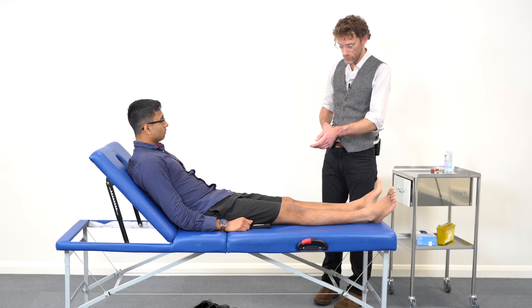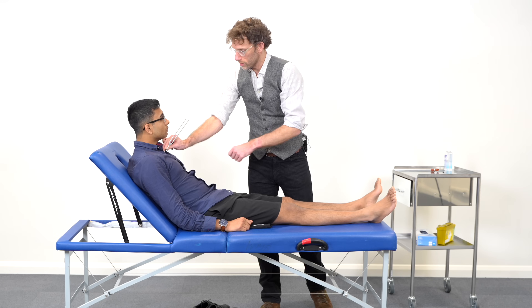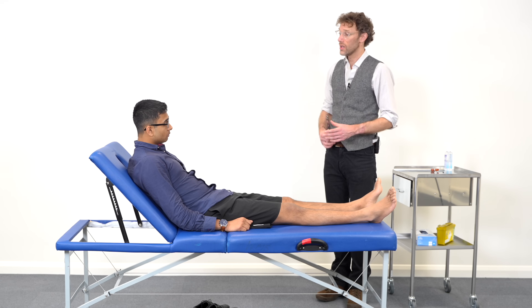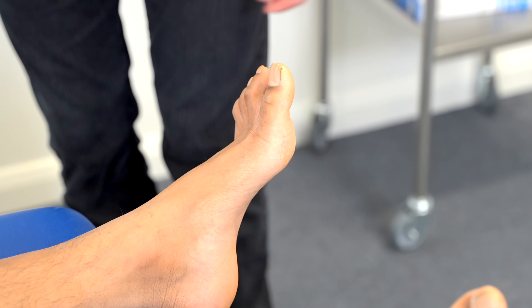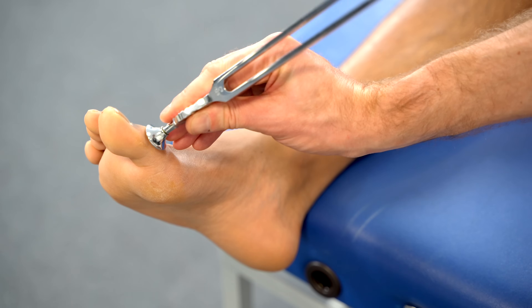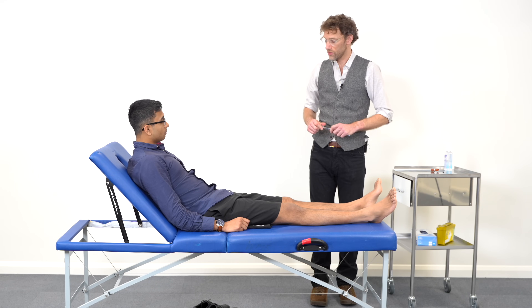Now I'm going to have a look at vibration. This is a tuning fork — if I strike it, it'll vibrate. I'll put it on your chest so you can feel the vibration. Tell me when it stops. I'm going to do the same thing on your toes. Close your eyes and tell me when the vibration stops. [Patient correctly identifies when vibration stops on both sides.] We've got normal vibration sense, so I've got no concerns about that.